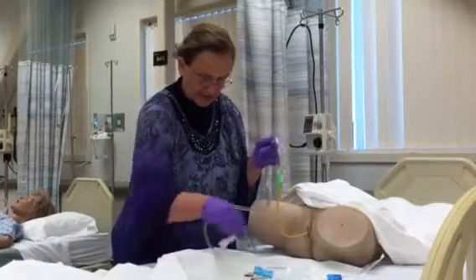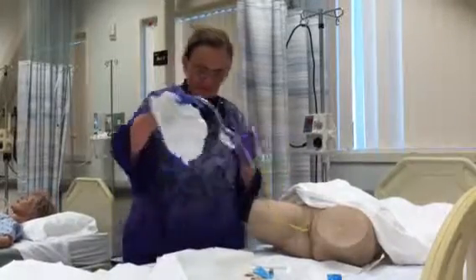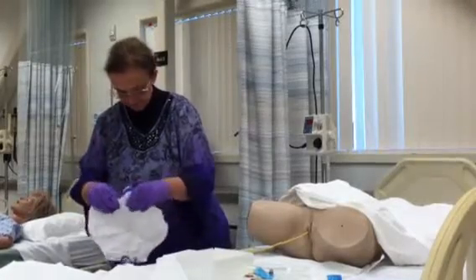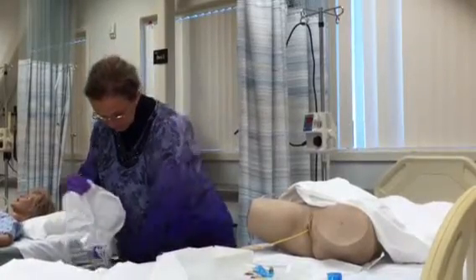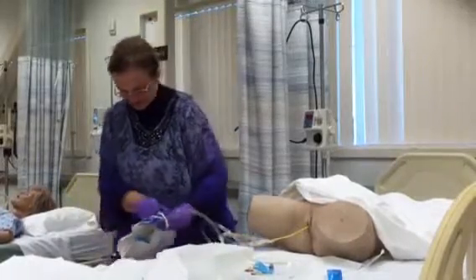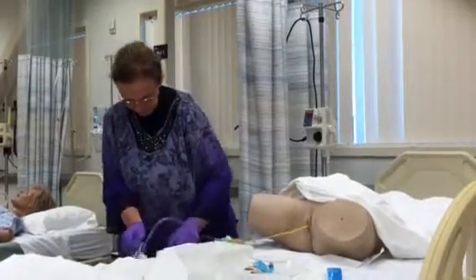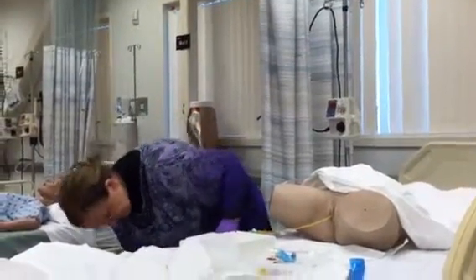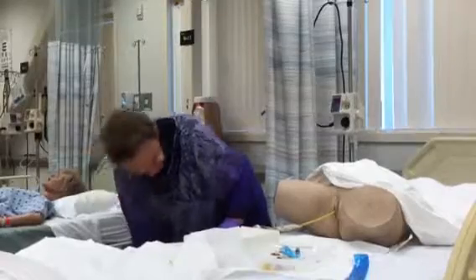I then will go ahead and hang my catheter on the bed. The urine will come into the catheter, and they've got some pretty cool things here. They've got a little hanger deal here, which is nice. And then there's a hook there, which is even better.